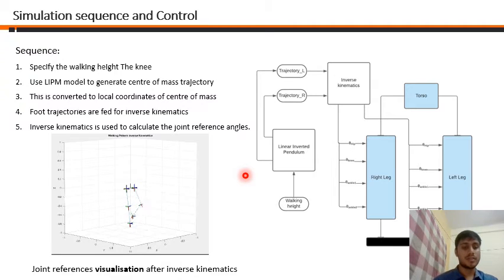In the video, you can see how by using inverse kinematics, we are able to determine the joint angles of the pendulum trajectory, which were shown earlier. These joint angles are then fed into the references of both legs, and Simscape numerical solvers solve the effect of the system containing the robot and the ground.